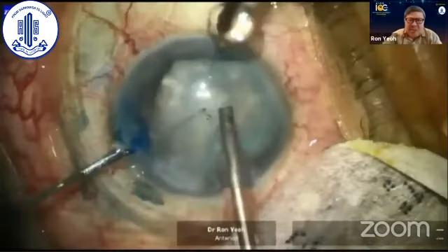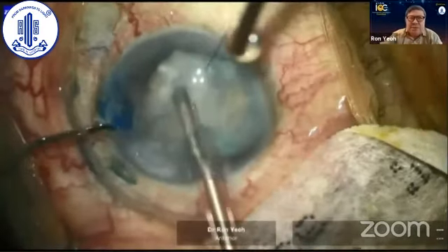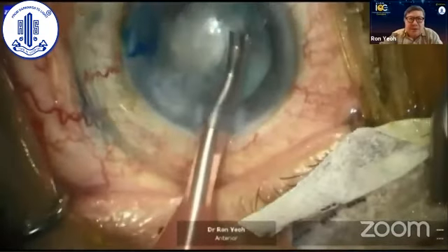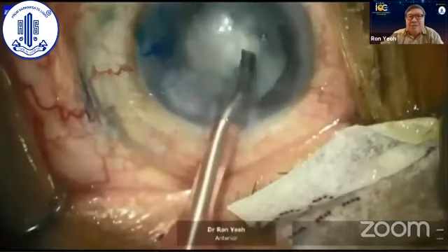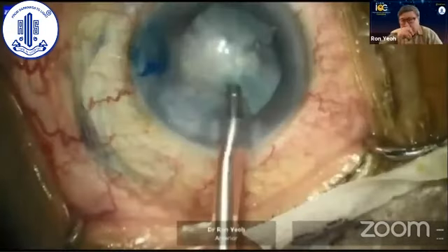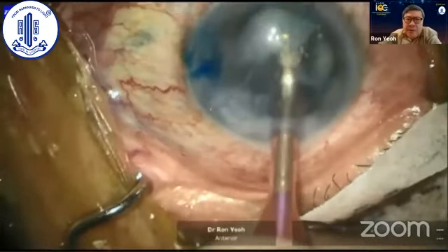This cataract was sticky and gooey and stuck to the capsule, and it really was stuck to all the other structures around the lens capsule. And it was a challenge. I thought this would be a simple aspiration of the cataract since it was just a 50-year-old. So being patient, I eventually managed to clear most of the white cataract away.